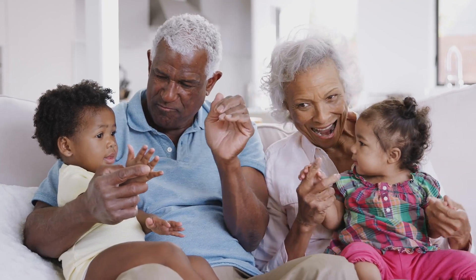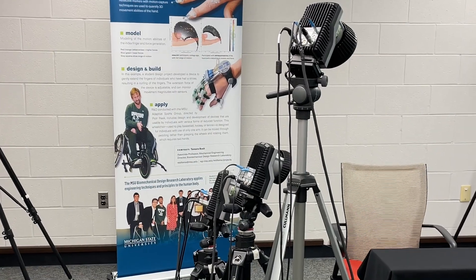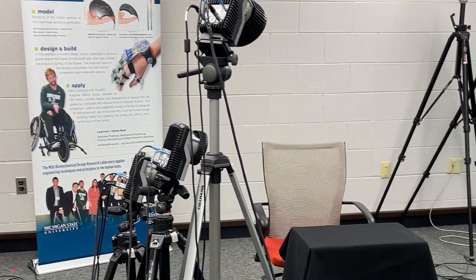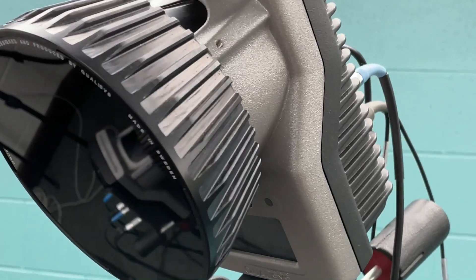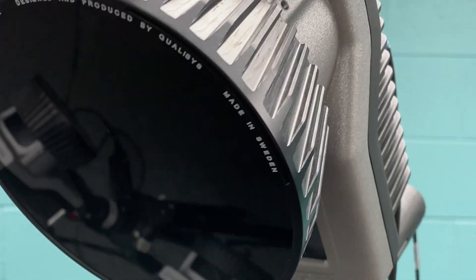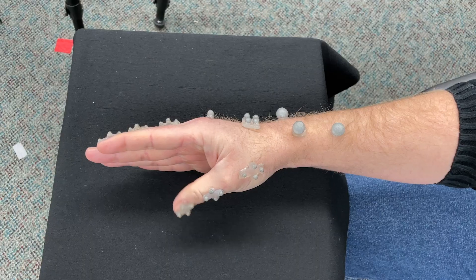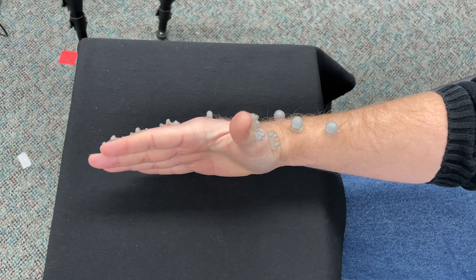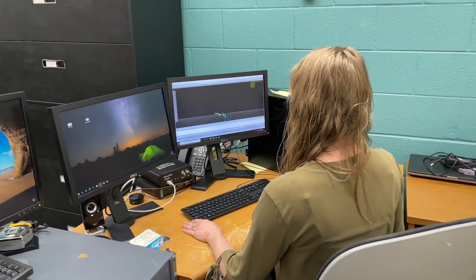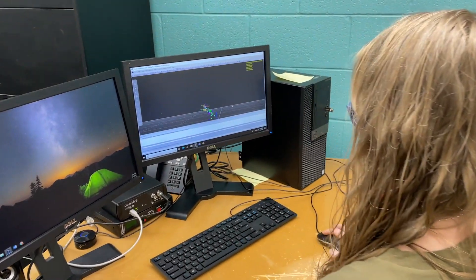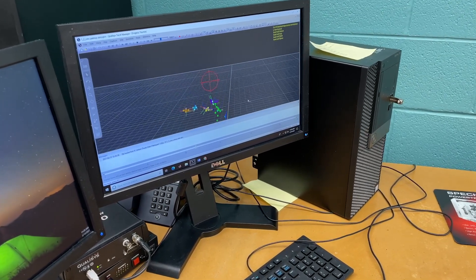We wanted to look at more complex motions, looking at motions in multiple degrees. We have a set of cameras with infrared light sources around each of the lenses, and we use these reflective markers — they're very, very small — and we place them on the hand. As the person moves in the space and moves their hands in front of the cameras, the cameras pick up those markers. We can look at multiple joints at the same time and do many other different types of calculations.